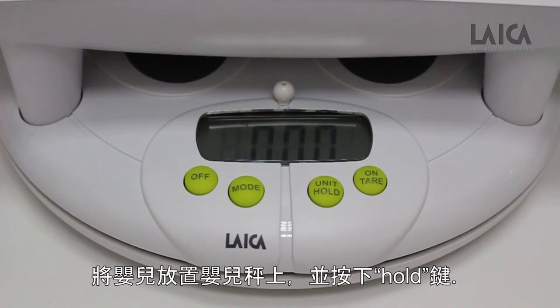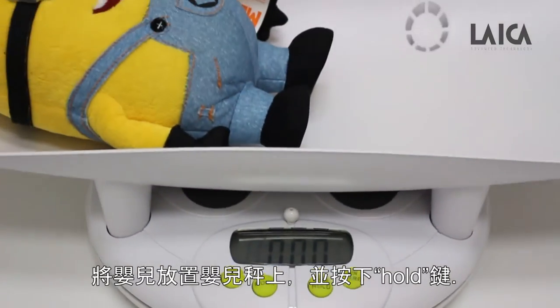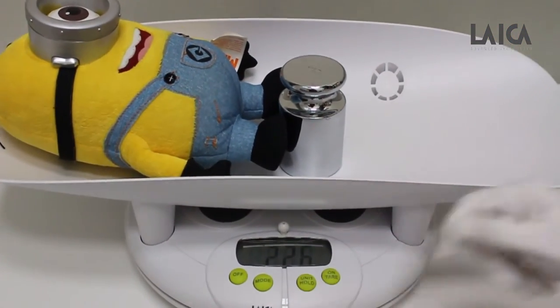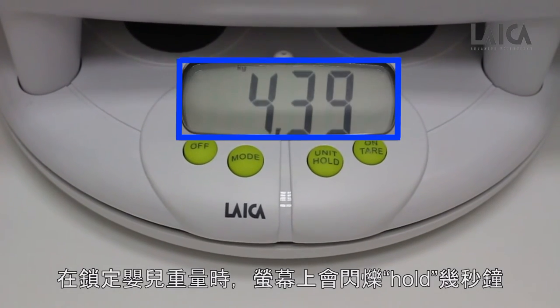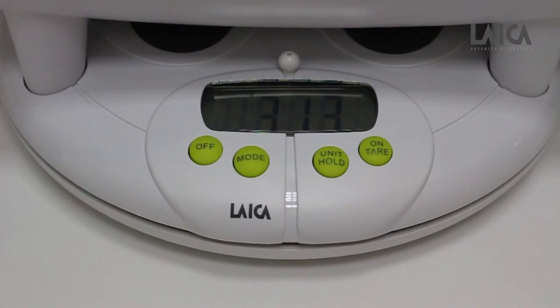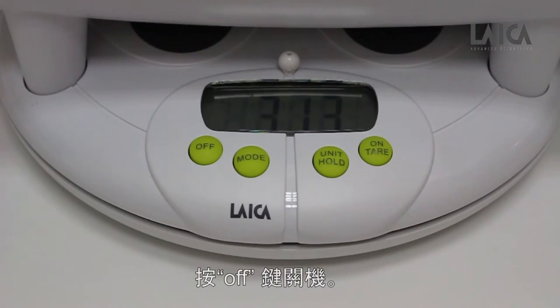When the baby is laid on the tray, press the unit/hold key. The display will flash 'hold' for a few seconds while the scale locks in on the baby's weight. When the 'hold' stops flashing, the weight of the baby is displayed. Press the off key to switch off.